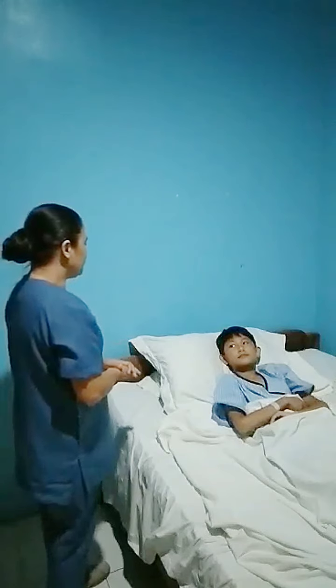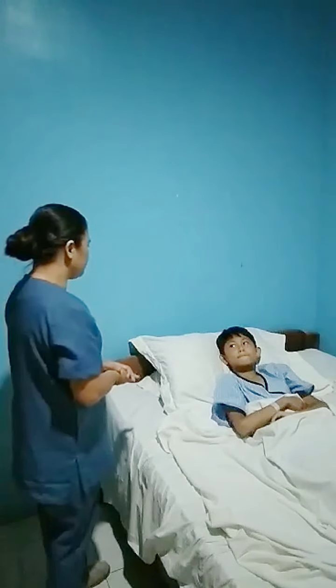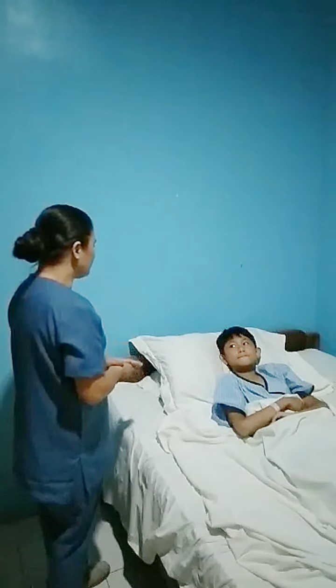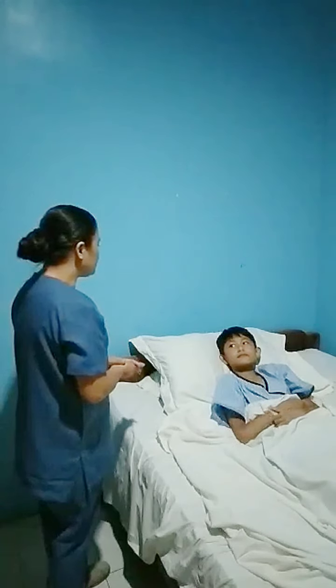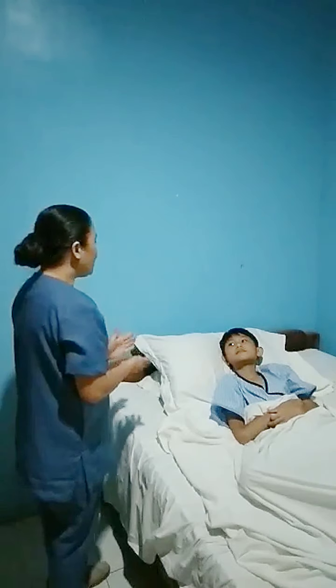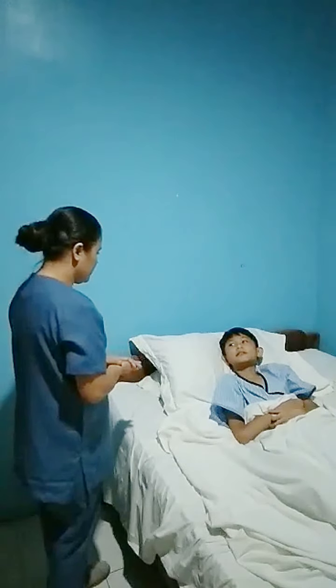So Ryan, your doctor has ordered that we must insert a nasogastric tube to your stomach. This procedure will be a little bit uncomfortable, but if you take deep breath and just relax yourself, it will greatly help us. Inserting this tube is very important because you aren't able to swallow food that your body needs. The tube will help us to give you the medication and the nutrients that your body needs for faster recovery.